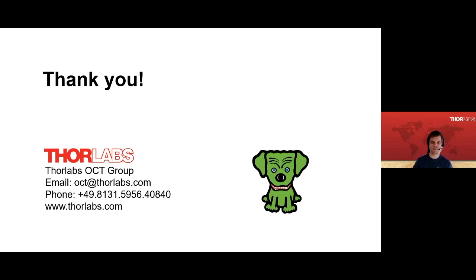Okay, and the last question, is the lateral resolution in OCT worse than in standard confocal microscopy? If yes, why? Usually it will be, just because you use a different numerical aperture.